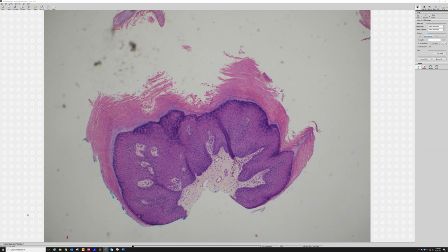You might have trouble seeing how this is a wart if all you've seen is the really dramatic ones, but I honestly probably see warts like this really often. Many of the warts I see do not make it into my study set over time because I only tend to save the really great dramatic ones and get recuts.